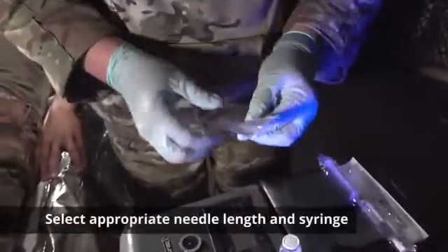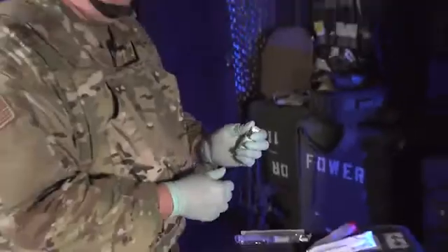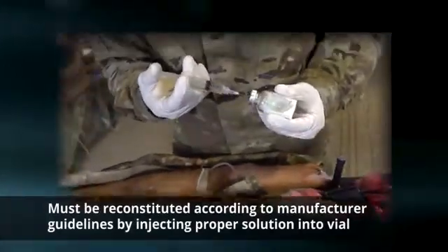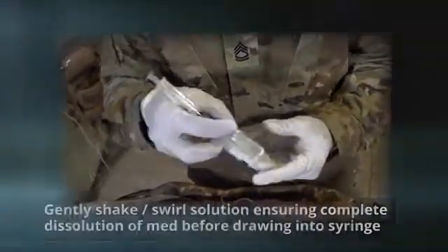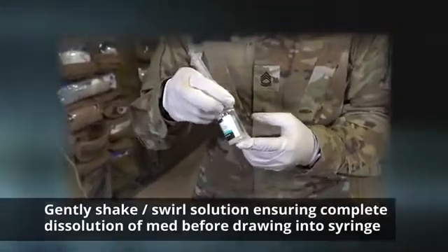Select an appropriate needle length. Select an appropriate syringe. Connect the needle and syringe. Inspect both the needle and syringe for any defects. Select and prepare the medication for IV injection. Vials that contain a powdered medication must be reconstituted according to the manufacturer's guidelines by injecting the proper solution into the vial instead of air, and then gently shaking or swirling the solution to ensure complete dissolution of the medication before drawing it into the syringe.